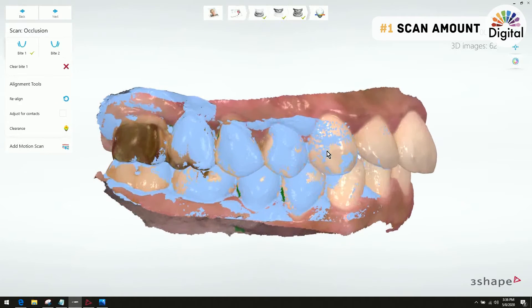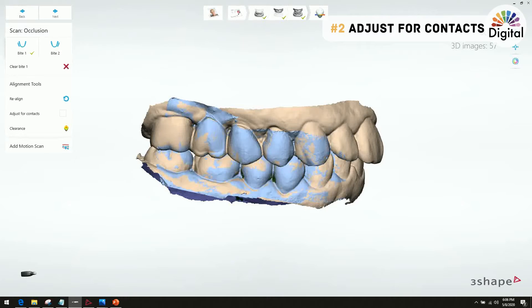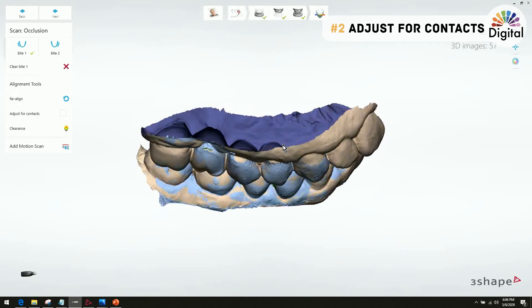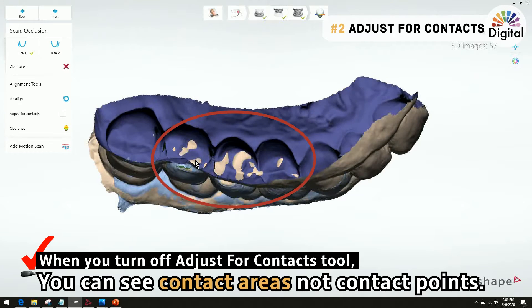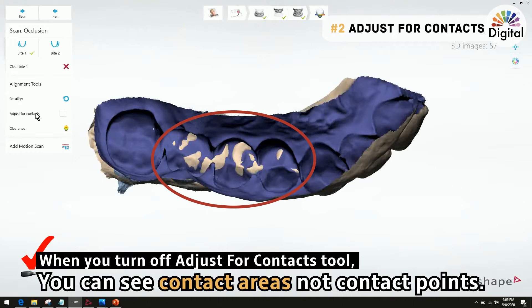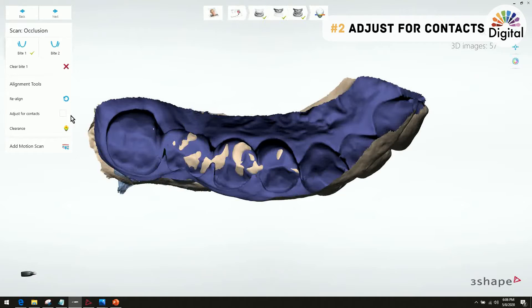This is Tip 1 about bite scan. The second thing I want to share today is the 'Adjust for Contacts' function, which is about occlusion contact. I turned this function off, and with my longer bite scan from molar to canine, we can see the contact area — not a contact point but a contact area — where they overlap each other. You can see a wider contact area with this tool turned off.